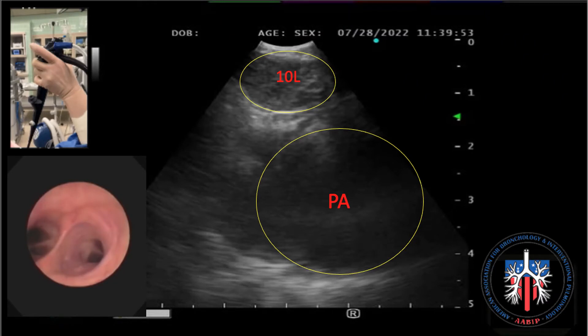The control lever should be slightly flexed and, starting at the 12 to 2 o'clock position, the hand is rotated counterclockwise until the lymph node comes into view.